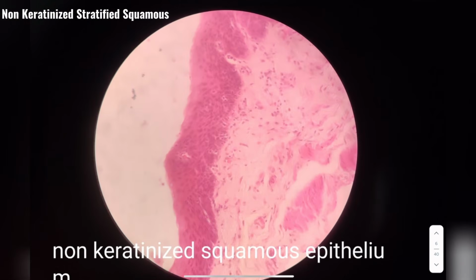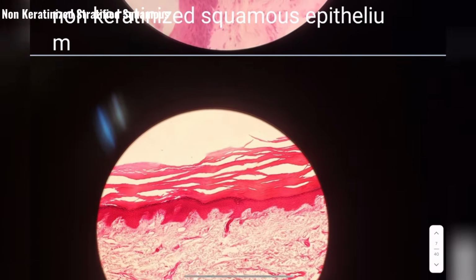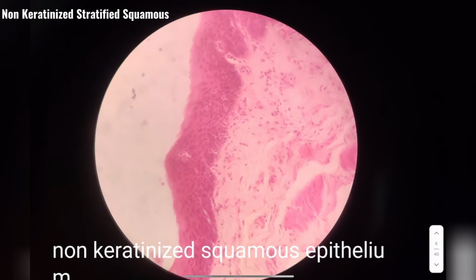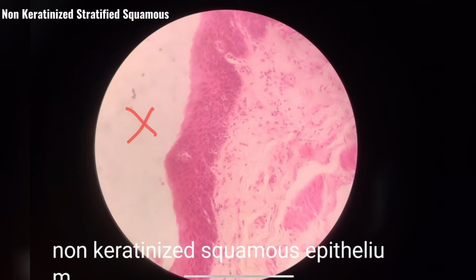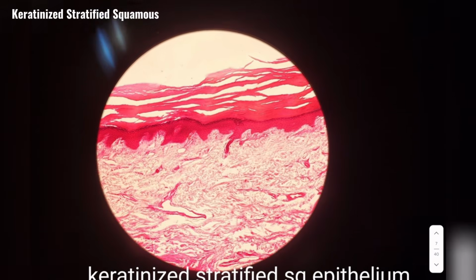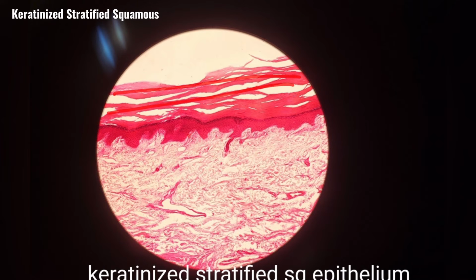But if it is not present, then it is non-keratinized. So you have stratified squamous epithelium without keratin deposition, so non-keratinized stratified squamous epithelium. Then you have stratified squamous epithelium with keratin deposition. So this is keratinized stratified squamous epithelium.